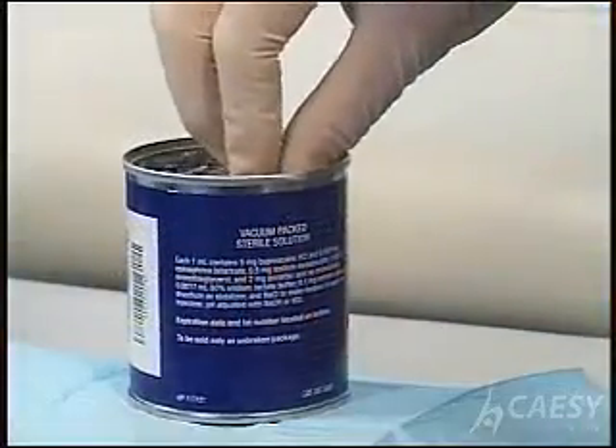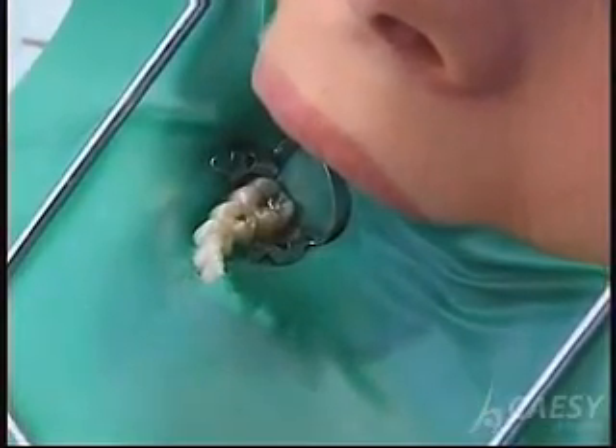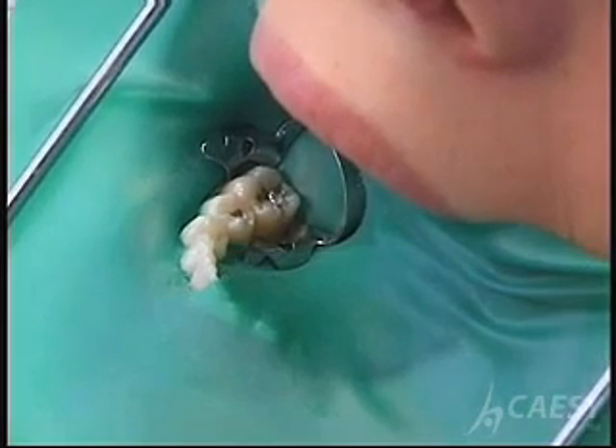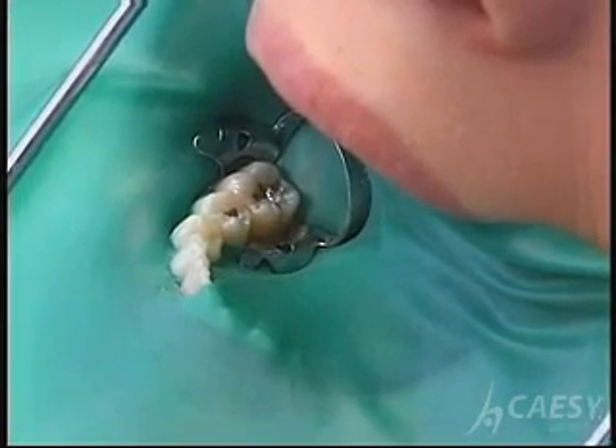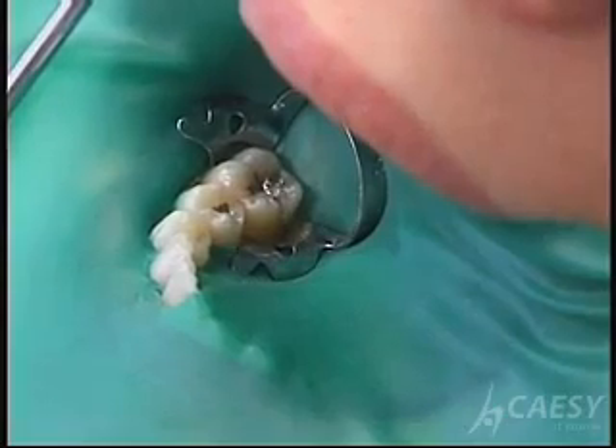We want the entire procedure to be comfortable for you. So the first thing we do is make sure you're thoroughly numb. We place a rubber dam around your tooth to isolate it from the rest of your mouth. It protects you like a safety net — nothing can fall to the back of your throat. It also keeps the tooth dry and accessible so we can do a better job.